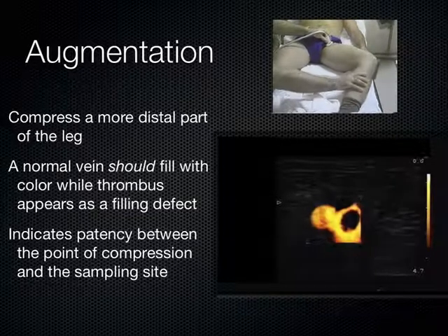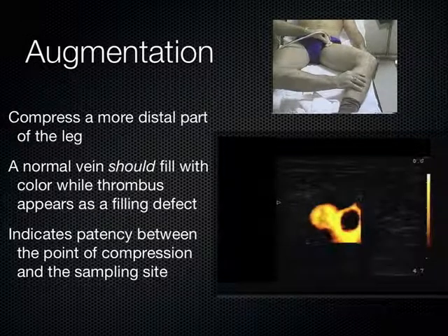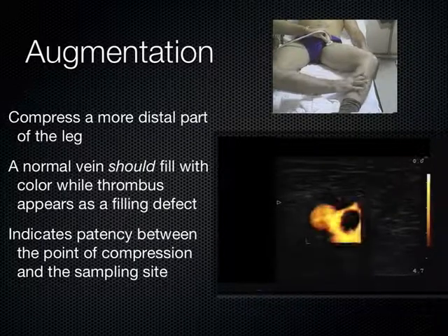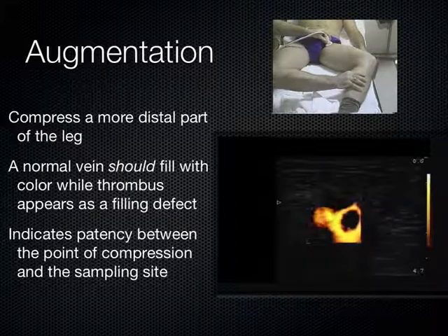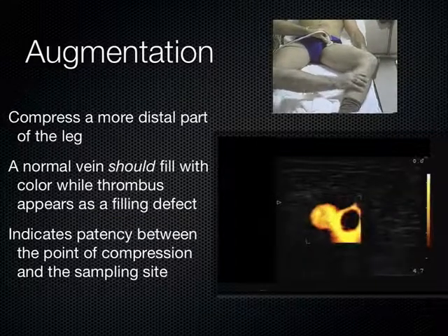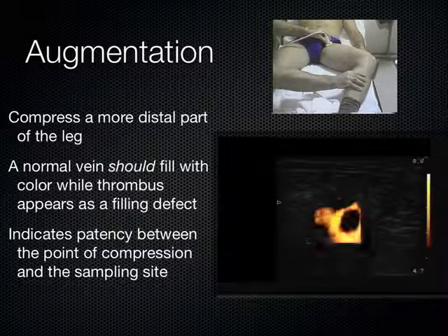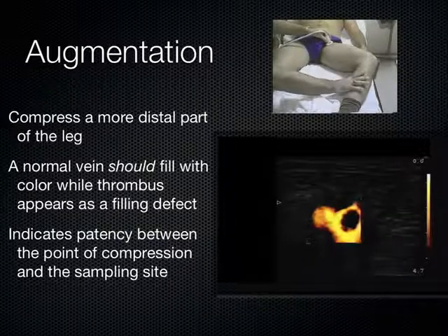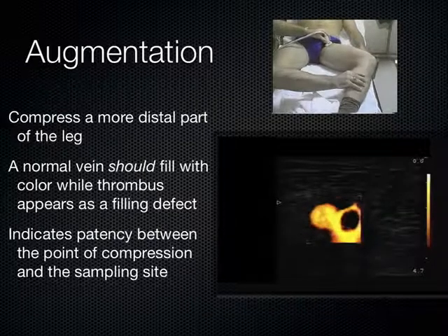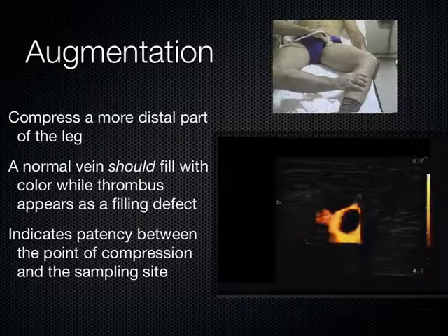And so this is going on all over the country still. It's amazing that this is happening. Still, it's so easy to do. Okay, that hemodynamic stuff we were talking about earlier, that's pretty high level stuff right there. This DVT stuff, really straightforward. And so this is one more reason why I am so passionate about teaching medical students ultrasound, is that when these machines are in your hands, when you're in practice, no matter what field you're into, you will always feel confident about your abilities to rule in or out a DVT.